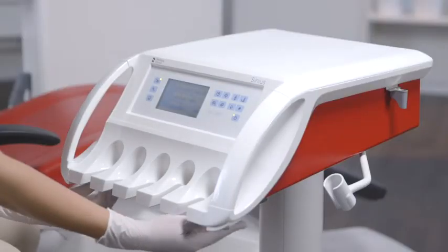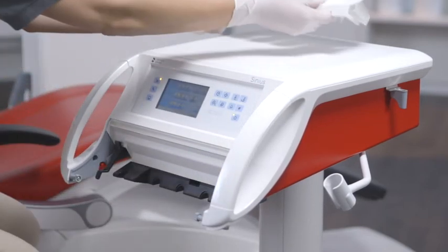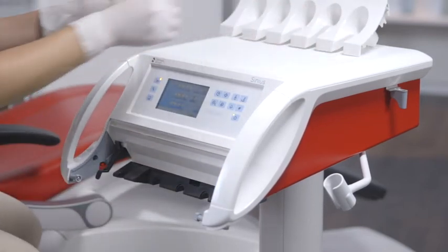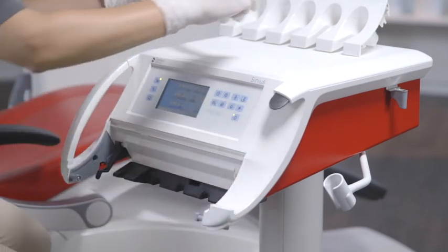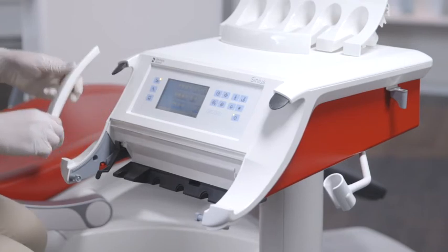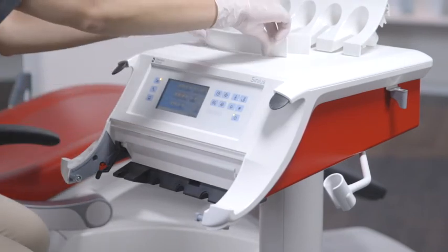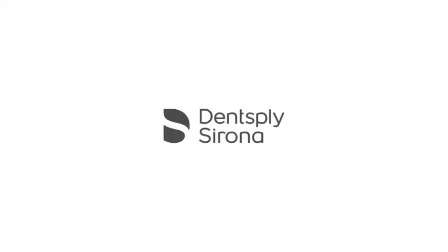Remove all infection prevention critical parts for reprocessing. Please ensure that the latches of the handles and the instrument holder are released. The instrument holders on the dentist and assistant elements, the handles of the dentist element, and the tray can all be thermally disinfected. The silicone pads and the handles of the operating light can be sterilized.